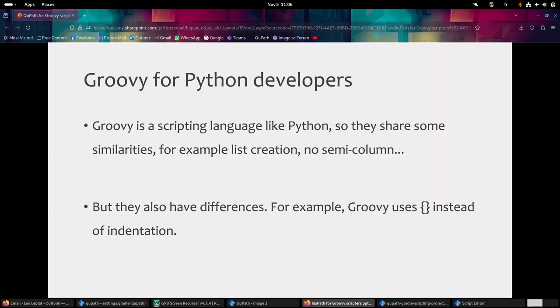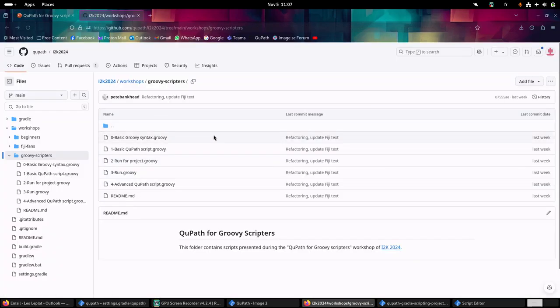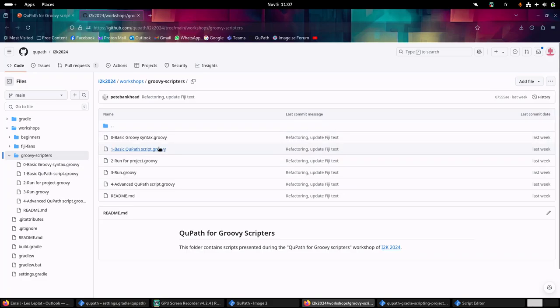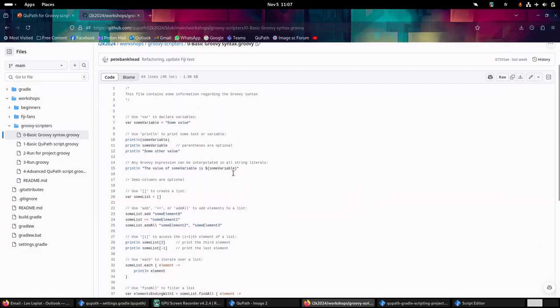If you have a Python background, know that Groovy is a scripting language - like Python, they have some similarities but also differences. I created a simple Groovy script that sums up some useful basic syntax. If you click on this link, you will see that I have created a few Groovy scripts that I will present during this presentation. The first one is the basic Groovy syntax script, and it shows some basic Groovy syntax that is not specific to QuPath, but is quite useful to know to create any kind of Groovy script.